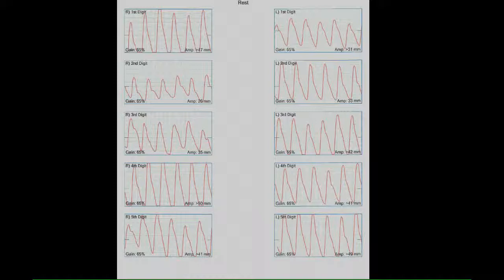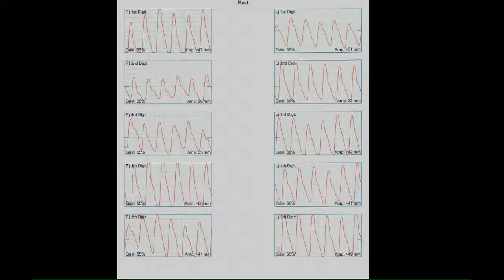Here, we have the digital waveforms obtained in all 10 digits with photoplethysmography sensors. Again, we will note sharp upstroke and dichrotic notch at all levels indicating normal flow at rest.